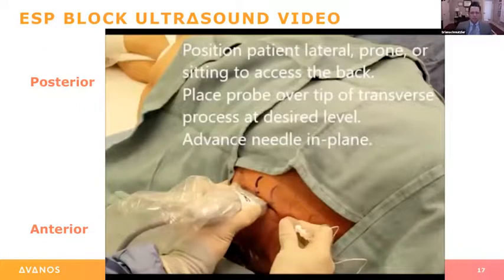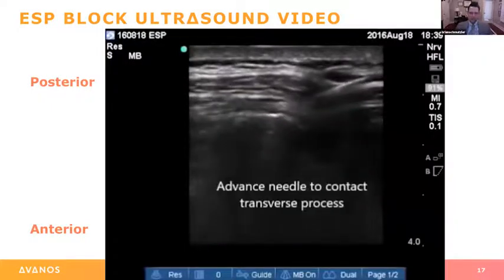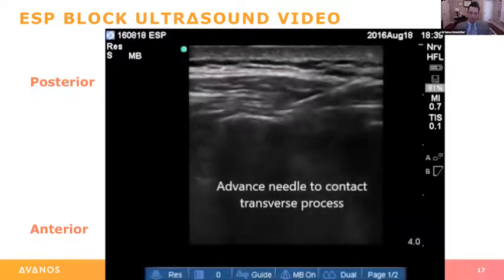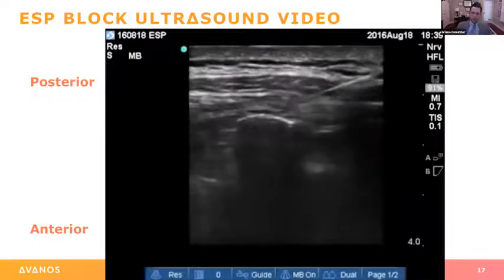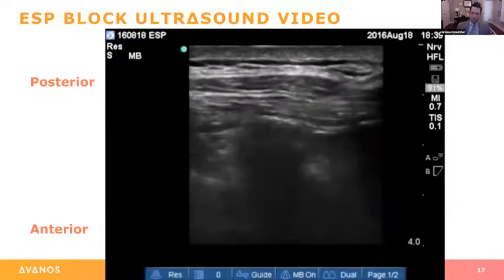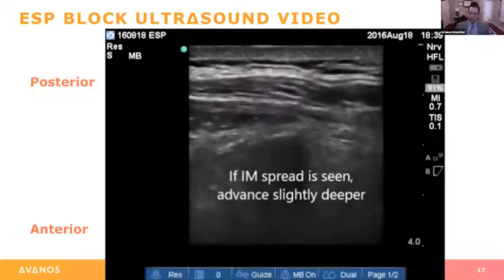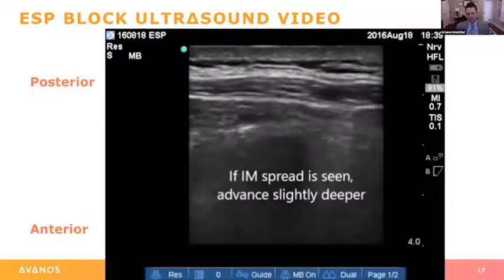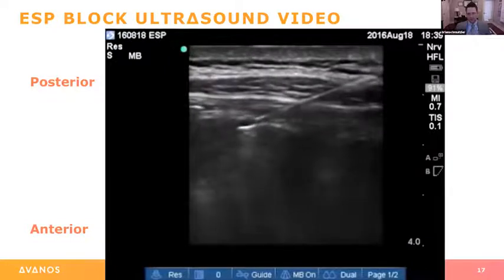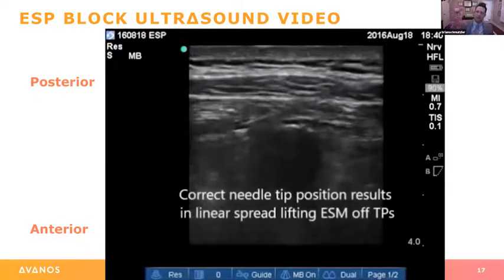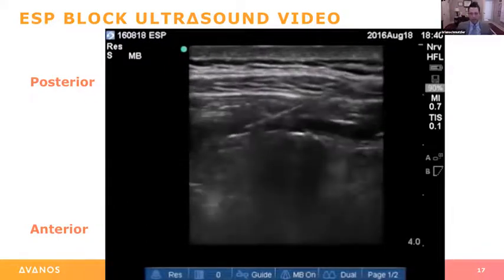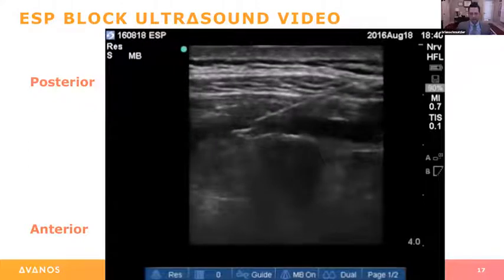This is a quick video — one we did in the lateral position. You can see the needle coming through. We're bringing the needle in and touching the transverse process. We start to inject and it looks like we're intramuscular — we're not under that anterior fascia. So we back up, redirect, scoot underneath that fascia, inject, and see it open up nicely. It looks like a fish mouth opening and closing. Once you get in the right spot, you can definitely tell.